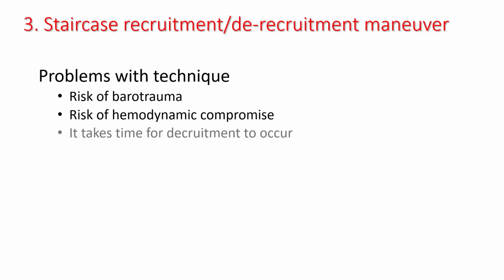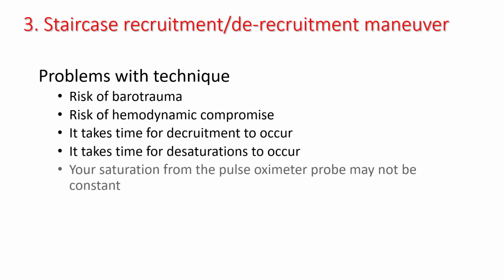The main problem with this technique is the risk of barotrauma and hemodynamic compromise when you are performing a recruitment maneuver. Since you are using the pulse oximetry probe, your saturation from the probe may not be constant.